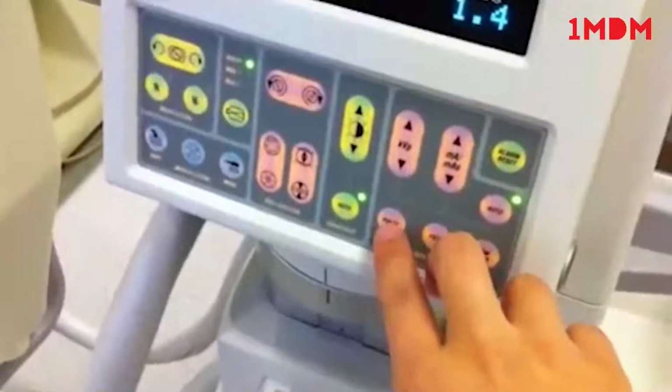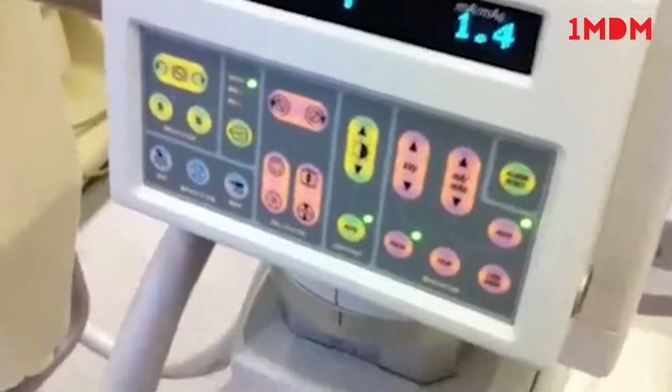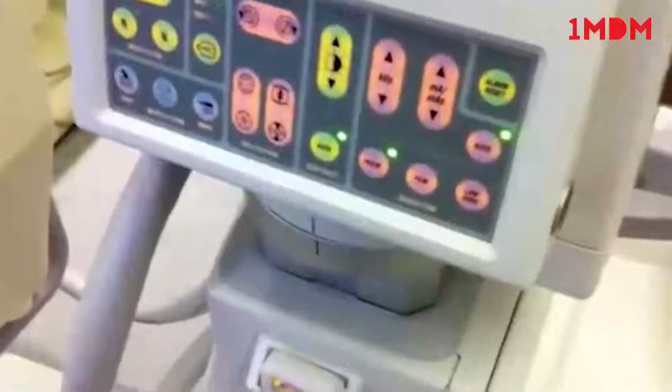The other function here is pulse. Pulse radiography is basically turning on and off the fluoro machine or the generator several times a second. Of course, you could change the rate correspondingly. This will reduce the dose significantly, as well as reduce fluoro time.